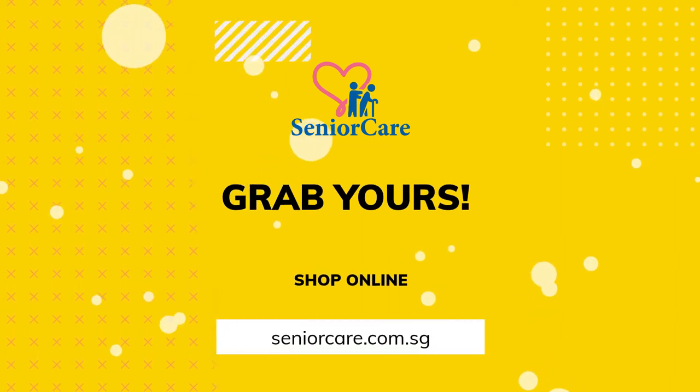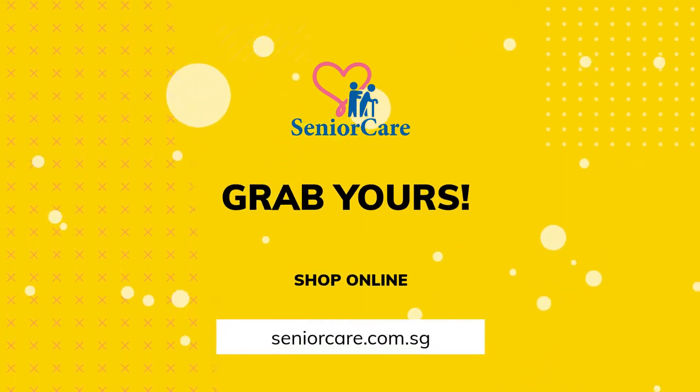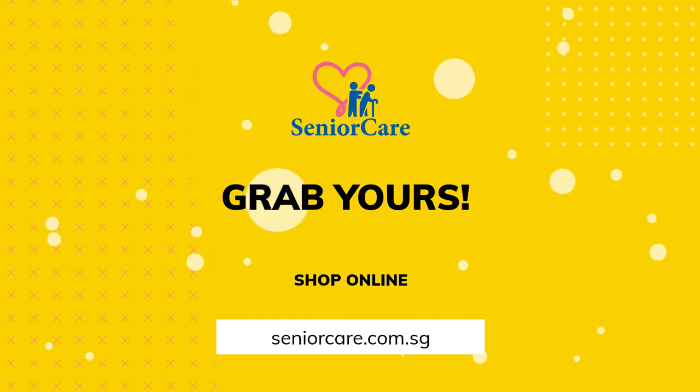Omron HN289 Digital Weighing Scale Machine is available at seniorcare.com.sg. Grab yours now.